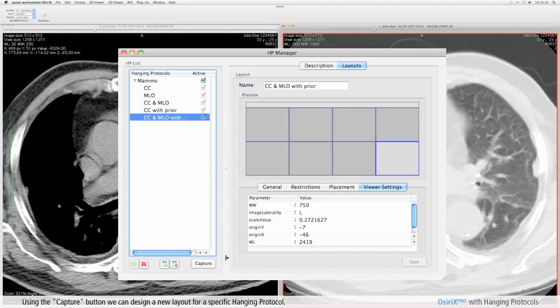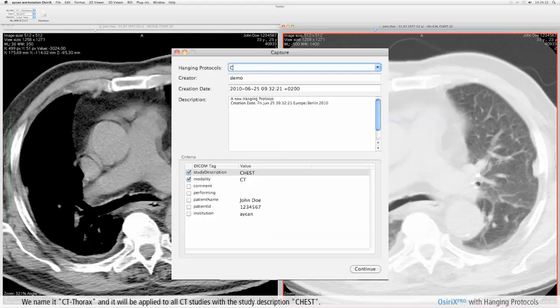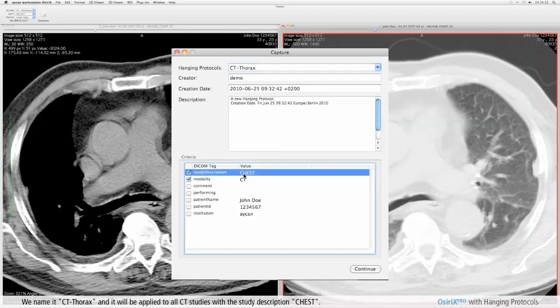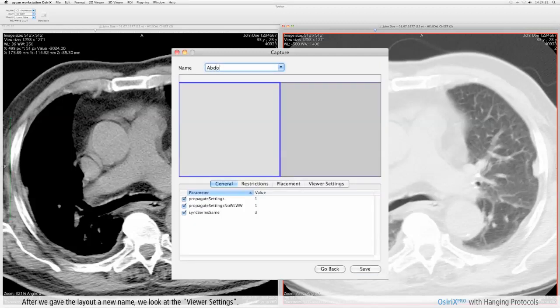Using the capture button we can design a new layout for a specific hanging protocol. We name it CT Thorax and it will be applied to all CT studies with the study description chest. After we gave the layout a new name we look at the viewer settings.